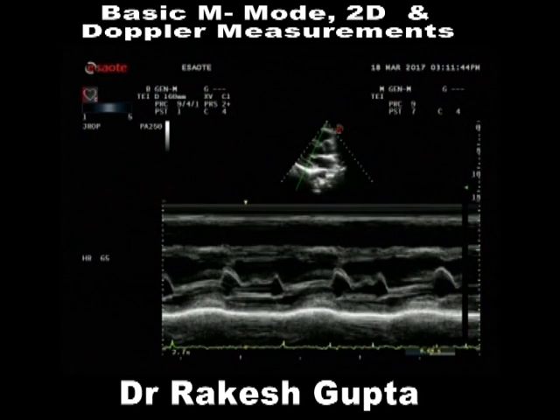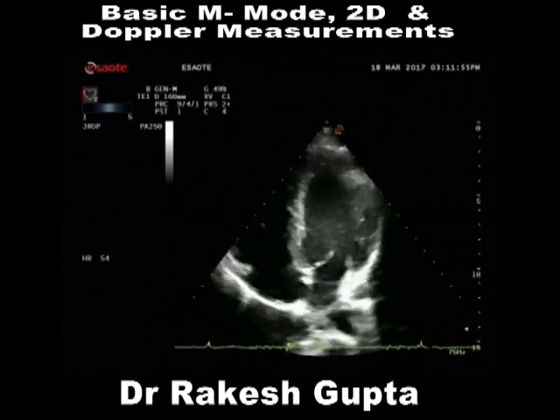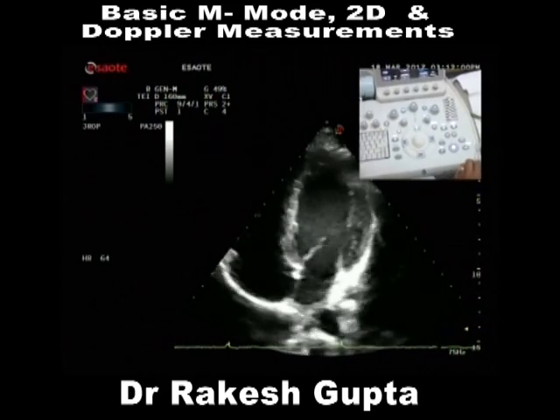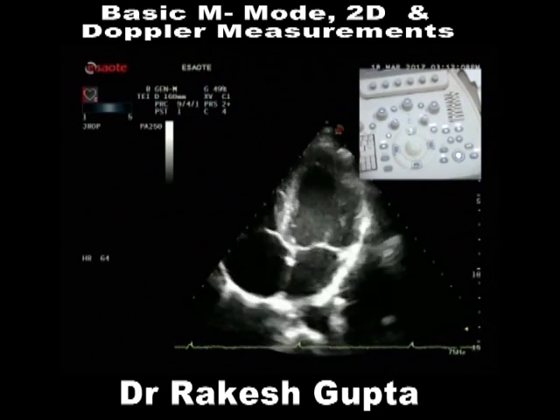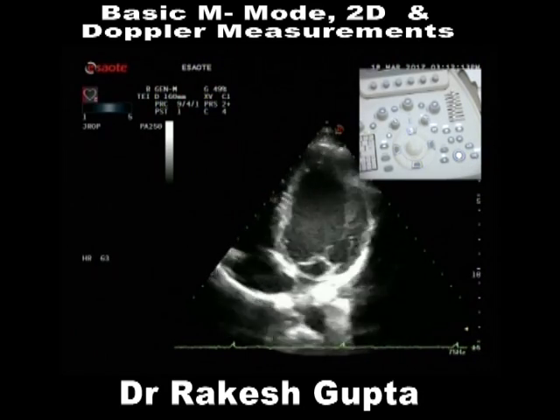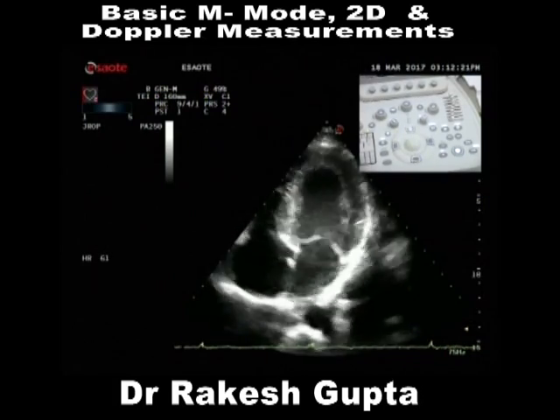Please put this on the keyboard, I will sit down, zoom the image. Now this is the most important thing: for ejection fraction, what do we need to have? We need to have a very good endocardial delineation. So I have to optimize my image. Can I have the pointer? Look, this apex should be in the center of this triangle. Make the box a little smaller, Anand ji, and smaller still.